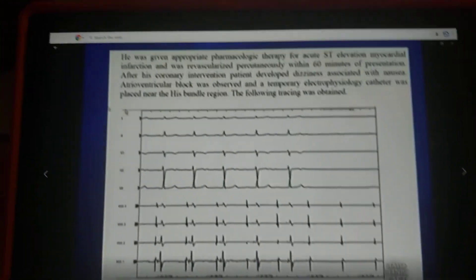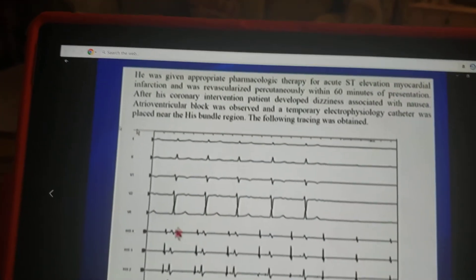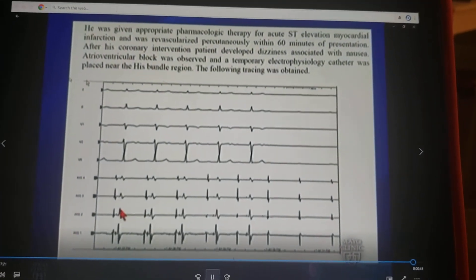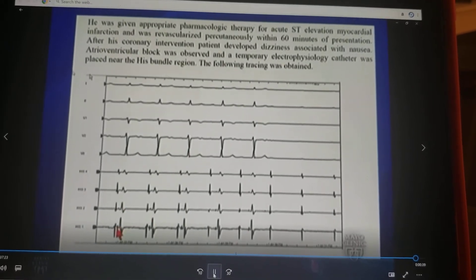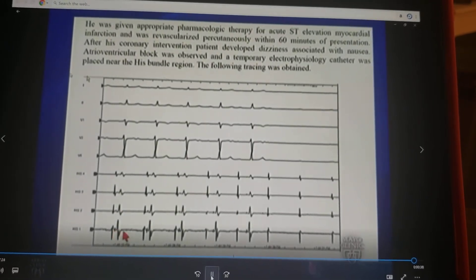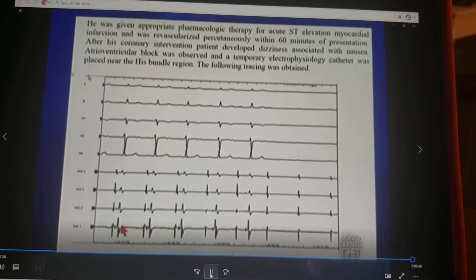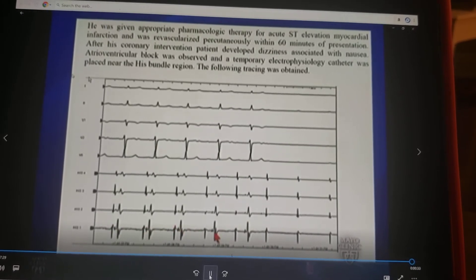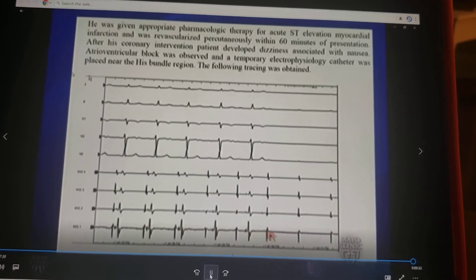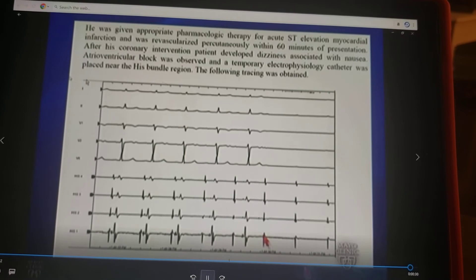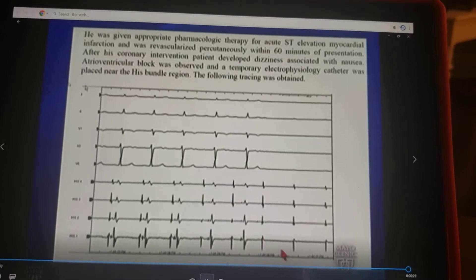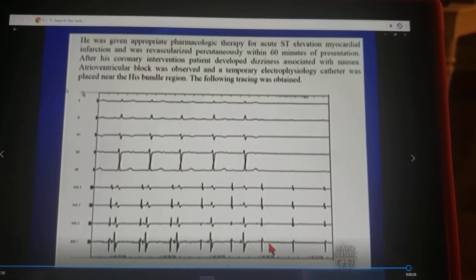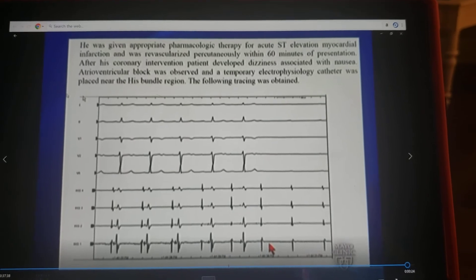Now, in this patient, we know that with inferior wall MI, the block is in the AV node. And they're testing this concept by giving you this HIS bundle electrogram. Notice that the AH interval prolongs before these P-waves that are not conducted. You don't have that HIS electrogram anymore, and it is benign.